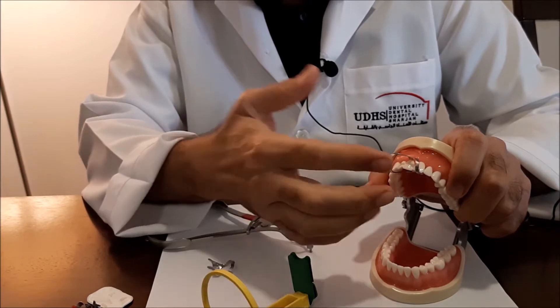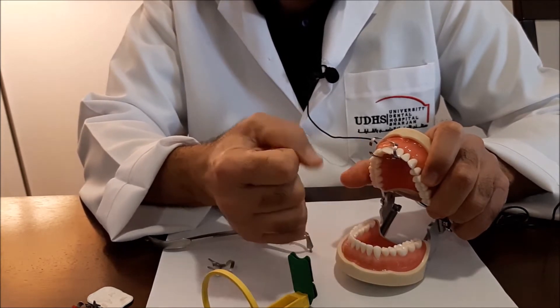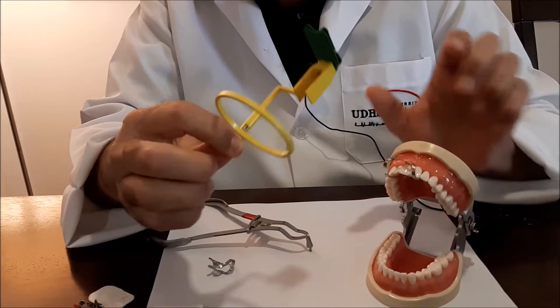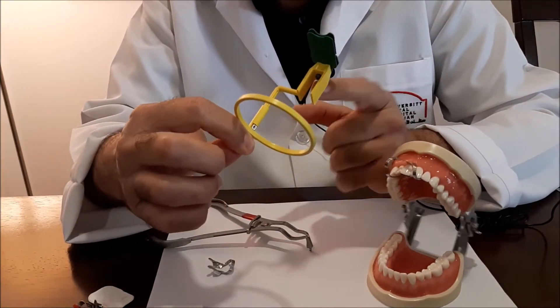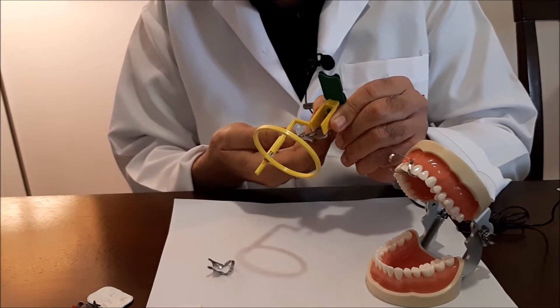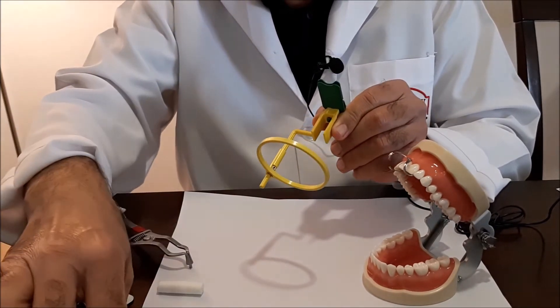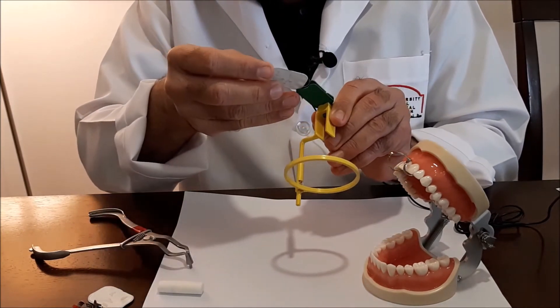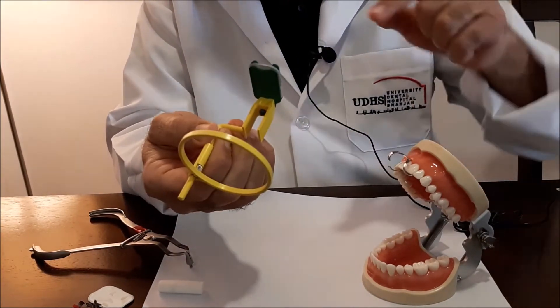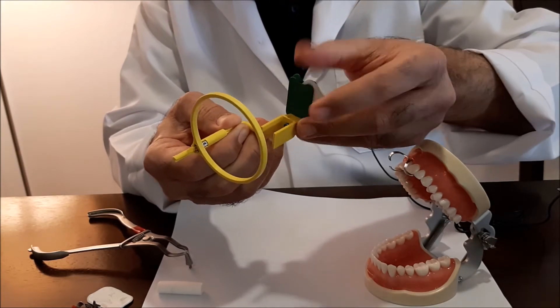Let's assume we are doing an endo procedure for an upper central incisor and the reamer or file — whatever intracanal instrument is being used — is projecting through the canal. These are endo bite blocks from Kerr. The bite block allows the reamer to pass through so you can take a radiograph. We place the sensor all the way down, making sure it is not tilted to either side.